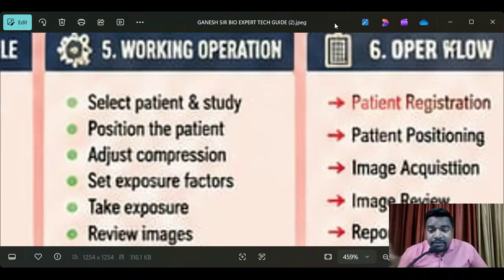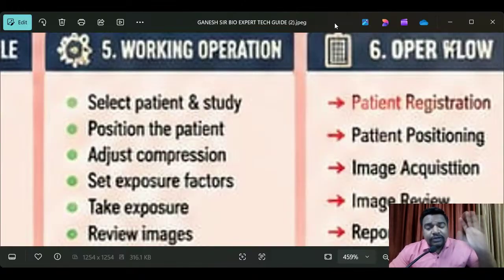As a biomedical engineer you should know this, but on a regular basis, who will operate this equipment? The radiology mammography technician and doctors will handle it, do the procedures and the scans continuously. But if you are a new engineer, they will call you, because the complete responsibility for the equipment is taken by the biomedical engineers.